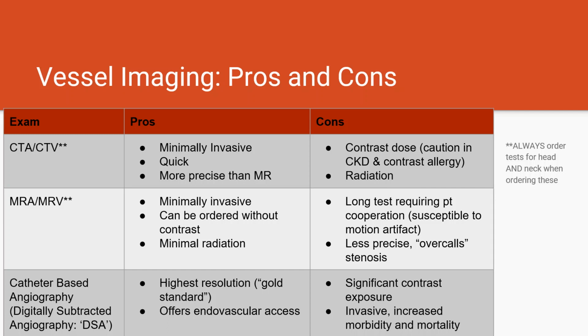These are the pros of the MR vessel imaging mostly: you avoid a lot of contrast and radiation. And in fact, MRAs and MRVs can actually be performed without using contrast at all.